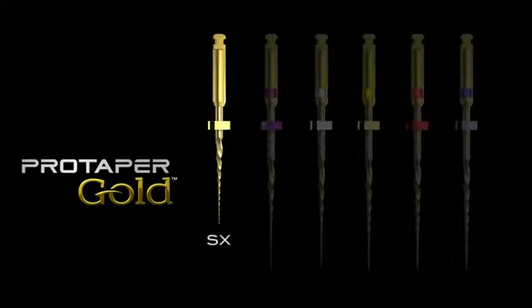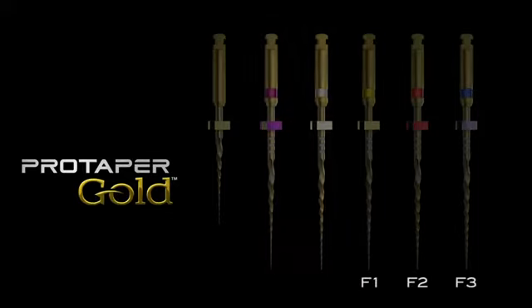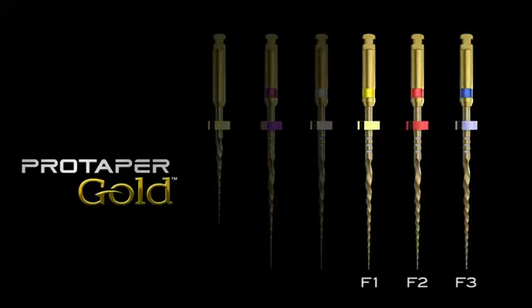SX is an auxiliary shaper designed to remove restricted dentin, and it has exaggerated progressive geometries. Shaper 1 and Shaper 2 remove the coronal and middle restrictive dentin in the glide path established canal. Meanwhile, the finishers 1, 2, and 3 simply connect the dots as finishing instruments for the preparation for a cone fit and easy obturation.